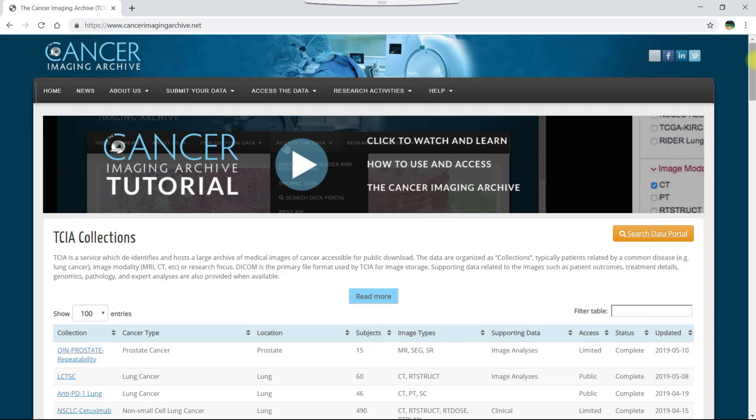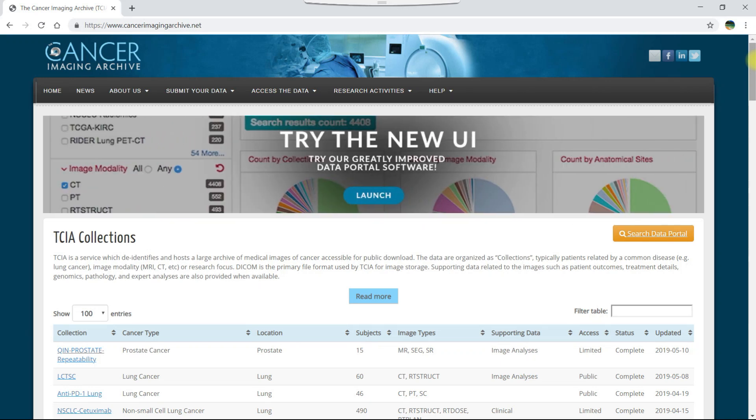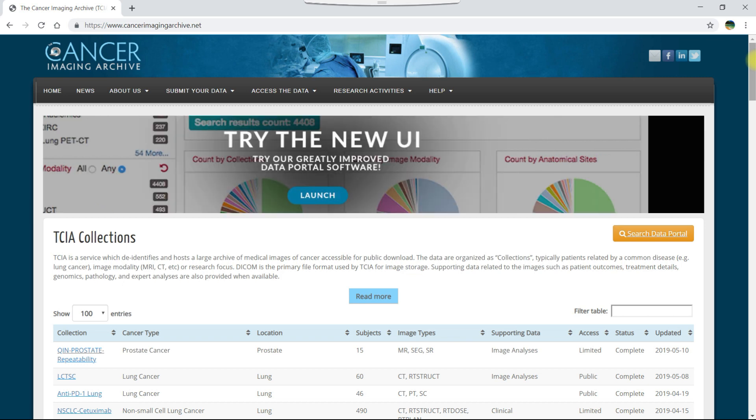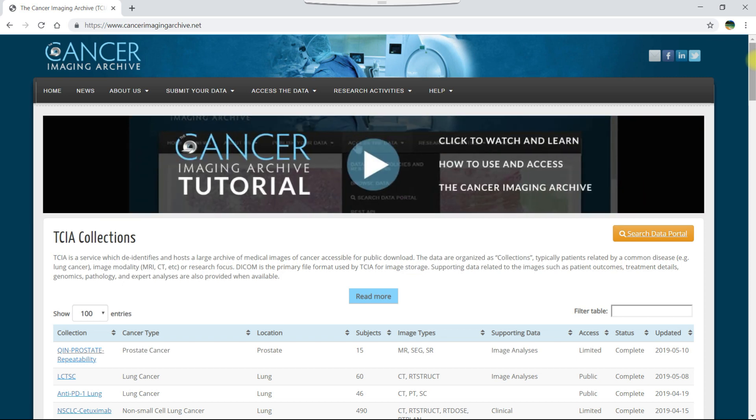Welcome to this video tutorial on how to download DICOM data in the TCIA data portal. Let's start on the TCIA homepage, which is CancerImagingArchive.net.